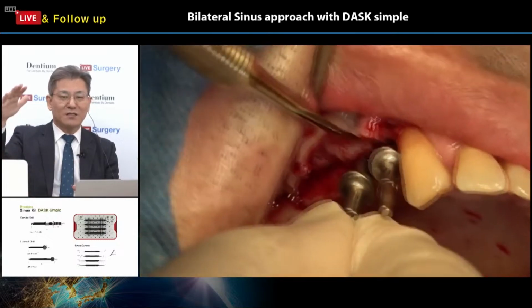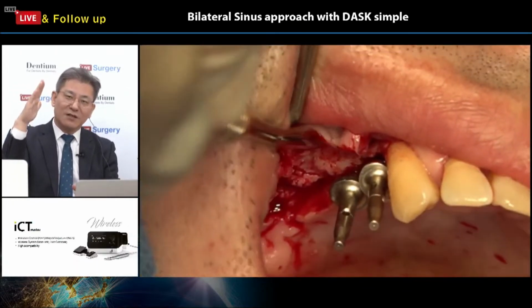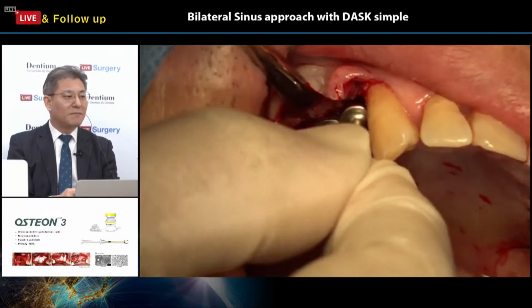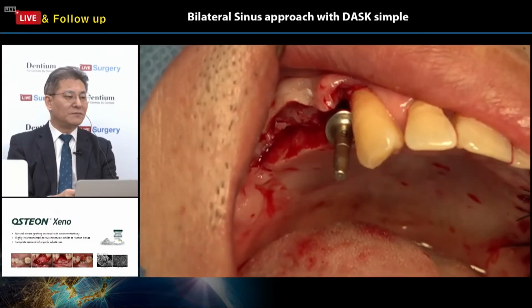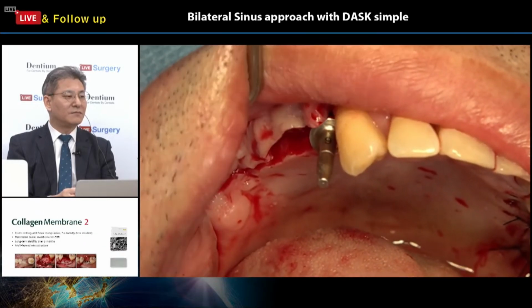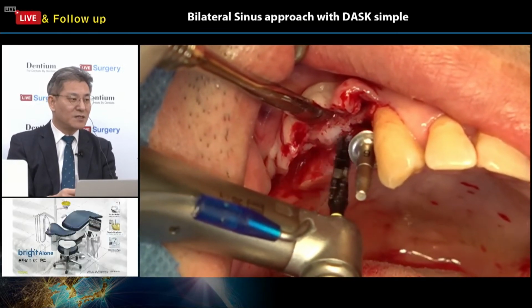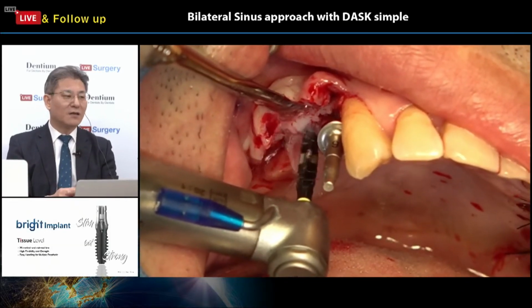Following this curvature, the number 14 or number 24 is a little bit inclined. The osteotomy is a necessary part. Okay, this diameter is 6 millimeter. Can you see the 6? Number 6. It means the diameter of the guiding pin.